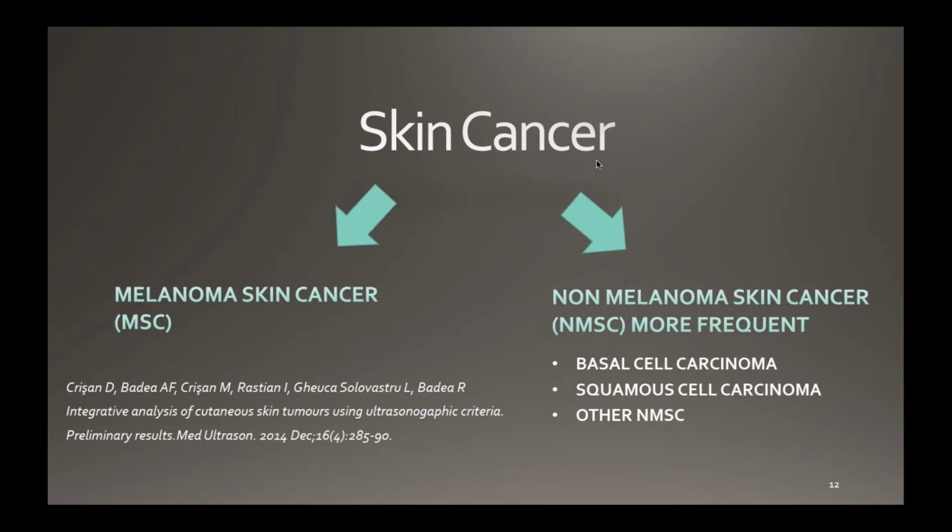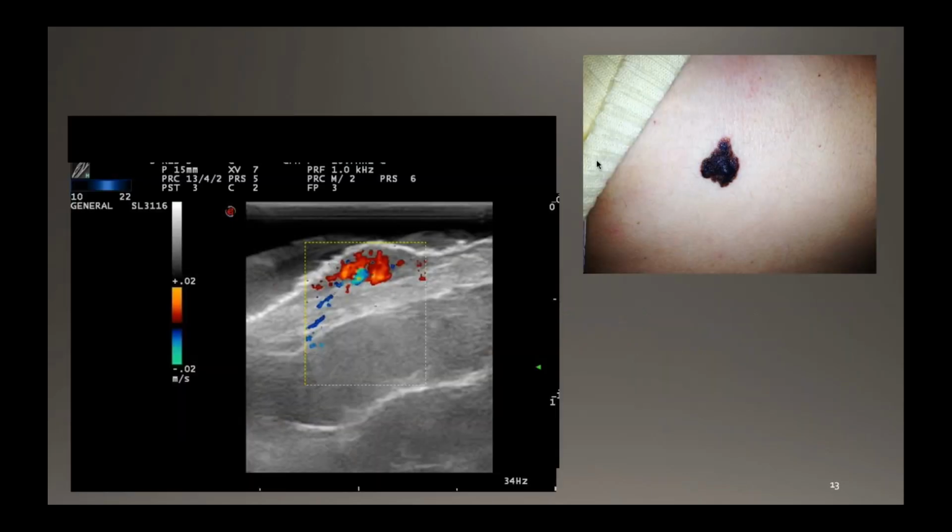In the follow-up, ultrasound is key to evaluate the state and the progression or the cure of these cancers. Also, in melanoma skin cancer, sometimes surgery must be directed in order to avoid complications or incomplete resections. Then ultrasound can be key, and that's information that you can offer to your dermatologist too.